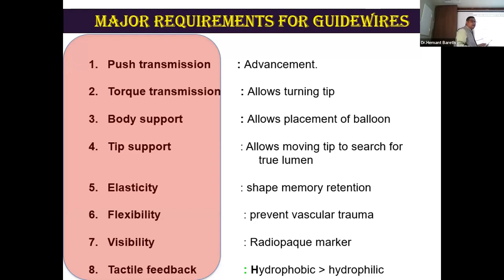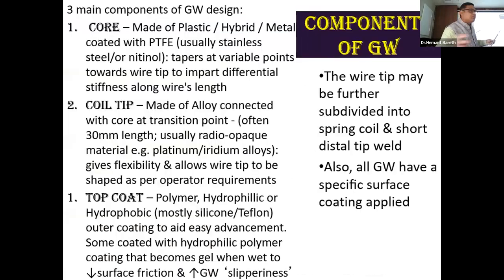Everybody understands visibility because you need to know where the wire is going. And tactile feedback, I already discussed with you. Hydrophobic wire or non-coated wires have the most tactile feel, versus hydrophilic or polymer coated wire, which don't have a tactile feel. So everything good so far?